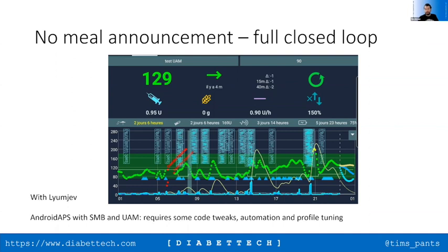For me, I just cannot use Mealtimes really well as a no announcement, no bolus model. High GI foods, I'm shooting up to far too high levels if I do that. Yeah, when I started on Fiasp, I thought, oh great, I'll try the no bolus thing, and I went out for Mexican, and that was a mistake. It works better when you've tuned everything very carefully.